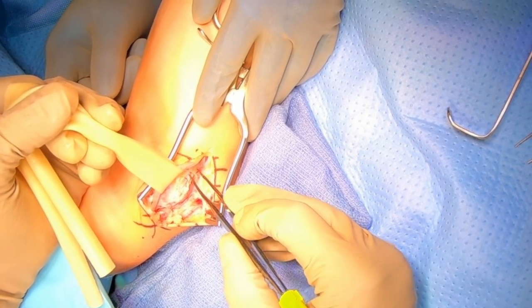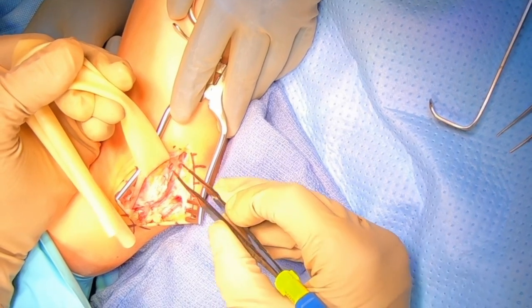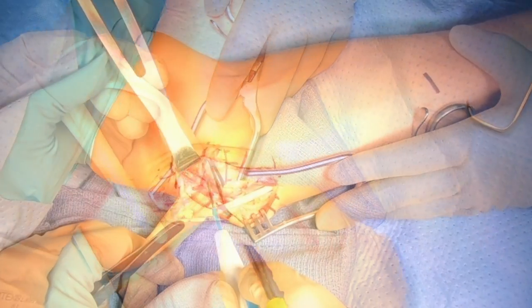That's going to be critical for this procedure because during the procedure we're going to need to work underneath where the nerve normally sits, which is the ulnar collateral ligament — which is what we're going to be repairing.